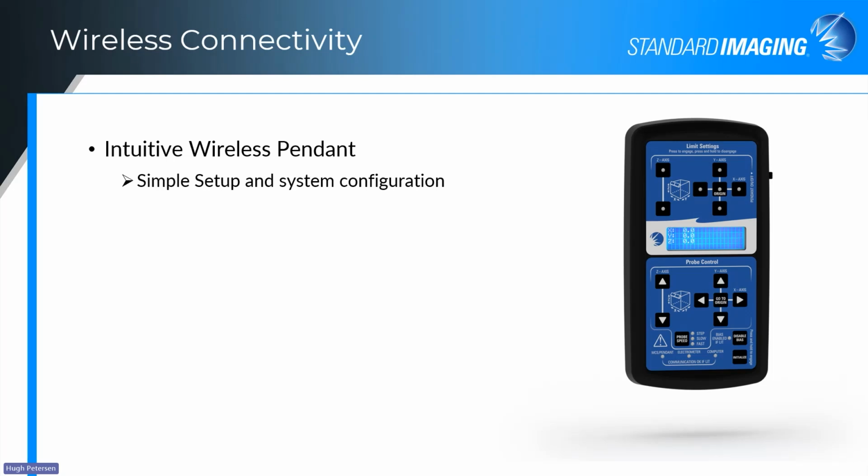The benefit with the water Phantom control system is you can walk around the Phantom to check your runouts, check your leveling, things like that, very easily, very quickly, and conveniently. It's just a nice feature to not have the pendant cabled to the system. The onboard display always shows your position, where you're at.